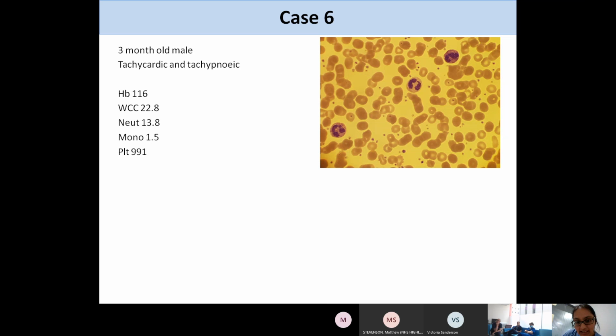What we can also see is 3 neutrophils. So this one looks relatively normal, except it's only got a couple of segments. This one's only got a couple of segments, maybe 3, and this one's got a couple of segments. Remember when I said usually neutrophils have 2 to 4 segments, and here you've got 3 examples of neutrophils, and they seem to have fewer segments than we would expect. The more segments you have, the more mature the neutrophil is. So this suggests that the neutrophil is slightly less mature than what we would expect to see in a normal film.